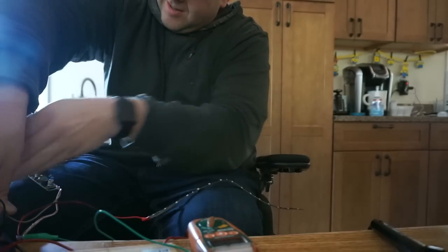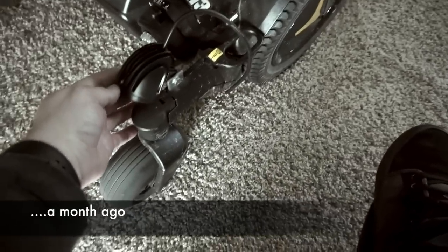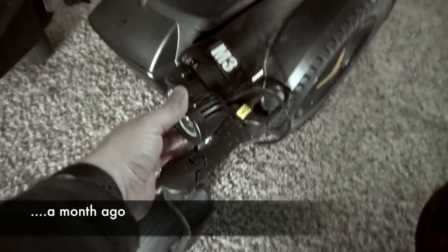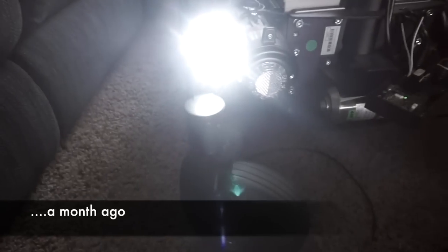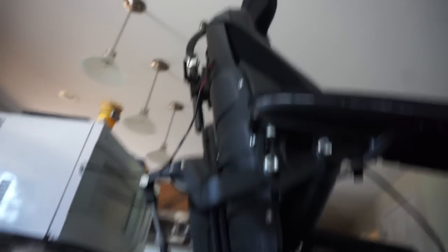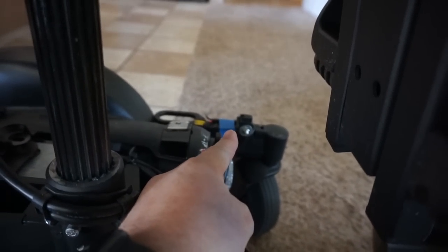I'm going to unplug this from my chair — I'm kind of surprised nothing caught fire. I think this is going to be better than factory; these lights are so much more stylish and they just fit in the existing brackets. So we ran our wiring for these lights down into the ICS control box — the wire goes down, does some mysterious things, and ends up on this box. When you push the button up here, you've got light. Now we've got side lights on here and some more strips up there on the back. We're going to add some extra connectors to get these hooked up and replace that light that's broken.